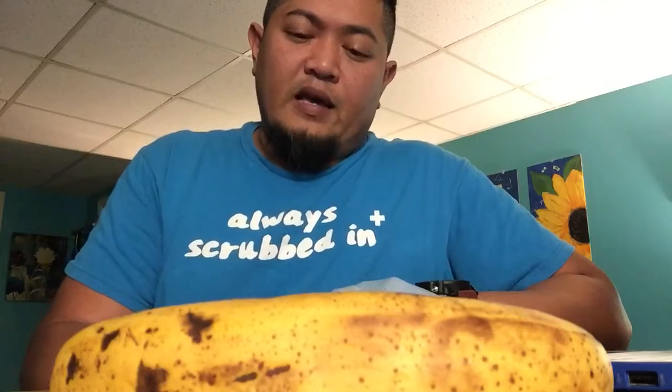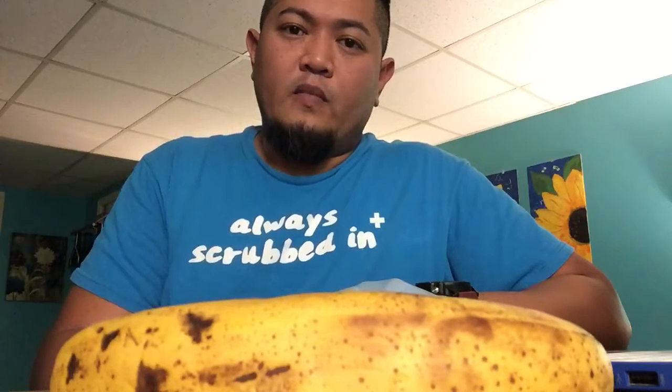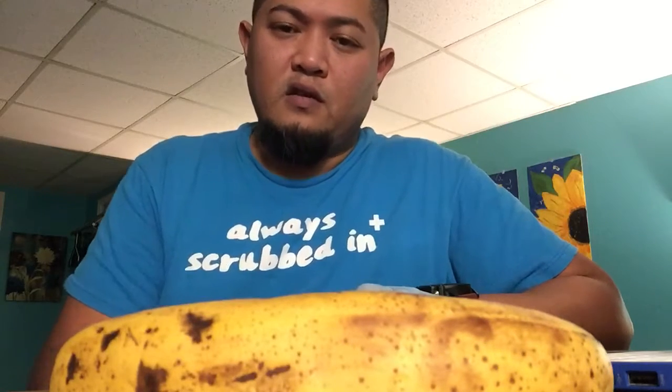And that is my video for drawing up medications from a vial and injecting medications not intravenously, subcutaneously. Thank you.